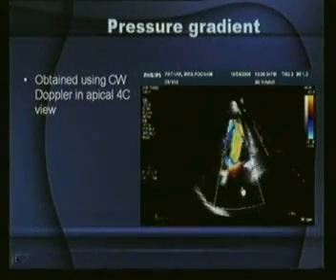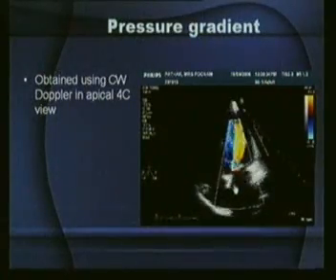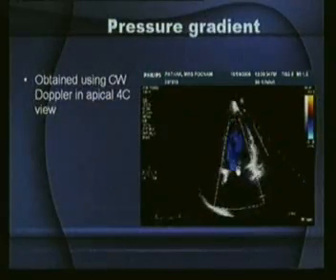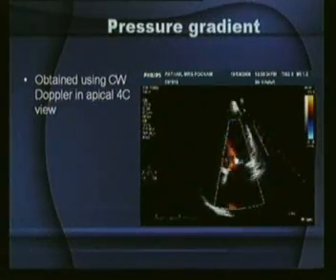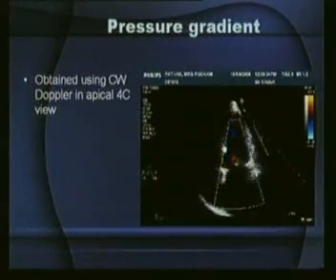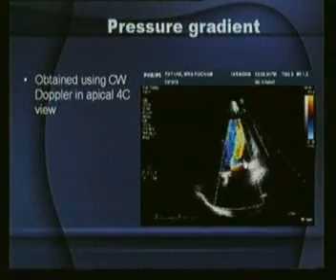So this is coming from a tight, stenosed valve. It has to flow from the LA to the LV, and this is mitral stenotic flow. When we then place a continuous wave beam, we keep it parallel to it, we will get the gradient, and I will come to that. Now, why are we saying again and again that we should position a continuous wave Doppler?